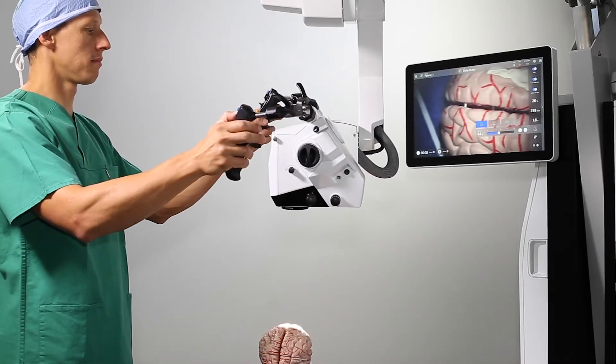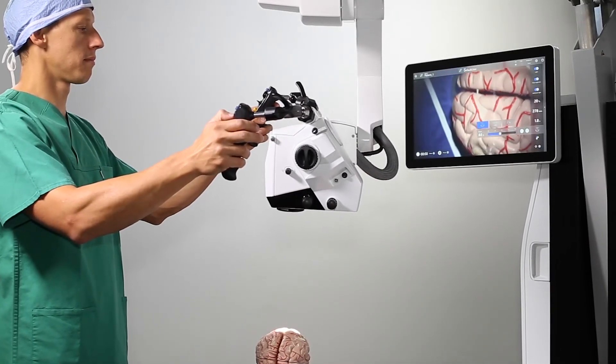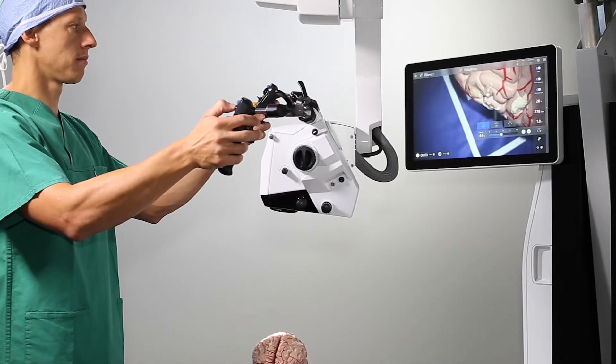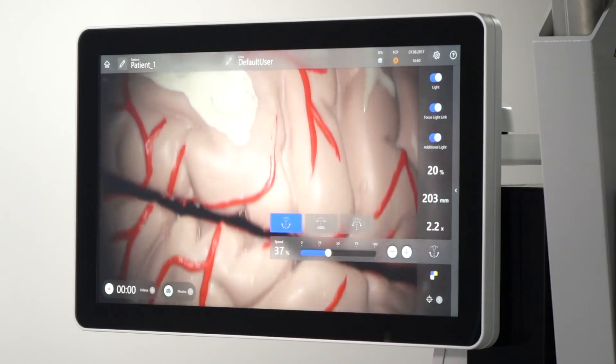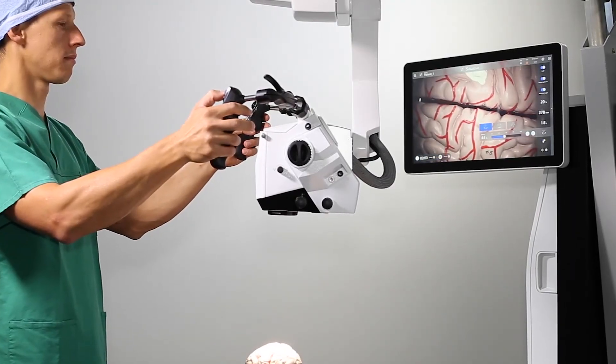Let us start with the XY microscope mode. It allows you to swivel to re-center your surgical landmark and to adjust your focal point. Use the XY joystick to control the movement.